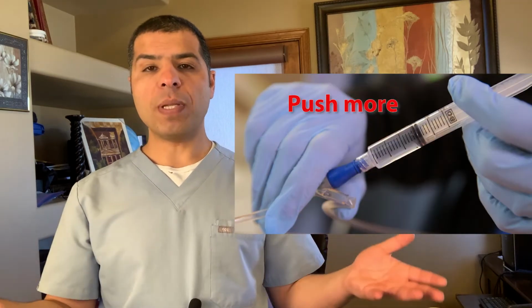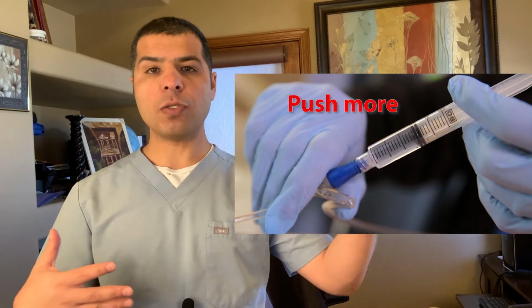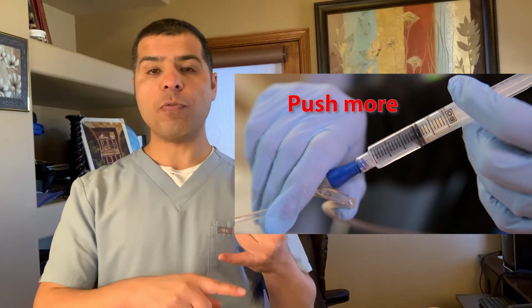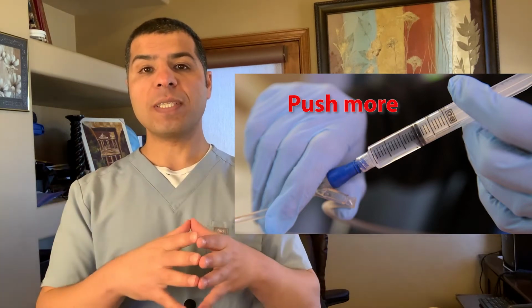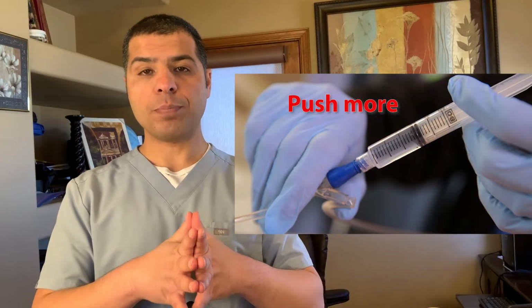You give more of that medication, like you could give 0.2 milligram per kg extra of etomidate, or you can add another agent. You can add propofol, ketamine, midazolam. Just make sure the patient is adequately sedated. And the same applies for paralytics.